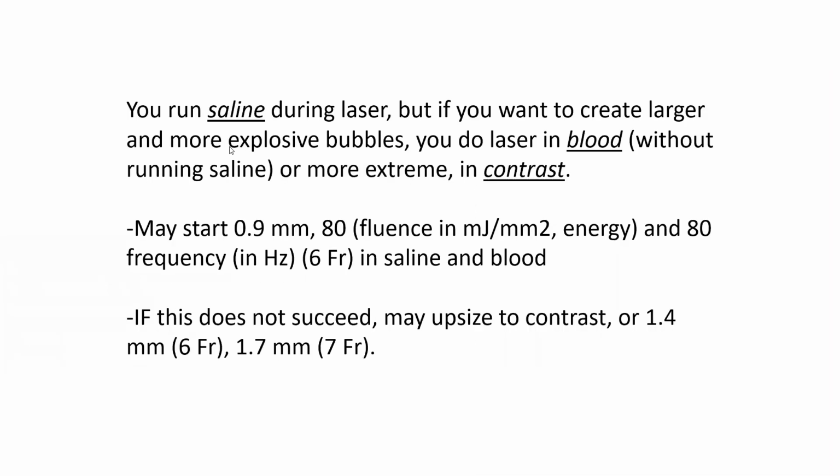When you're running laser, you should typically run saline. But if you want to create larger and more explosive bubbles, you don't run saline. You let the blood run. You create more explosive bubbles. Or in more extreme cases, you actually inject contrast. This is where you create the most explosive bubbles if you need to, but also a higher risk of perforation. It is off-label to use contrast with laser.